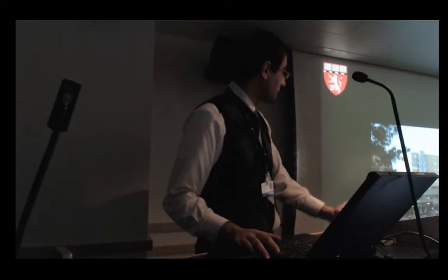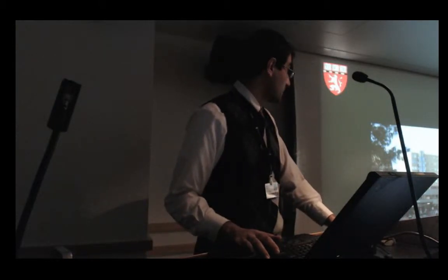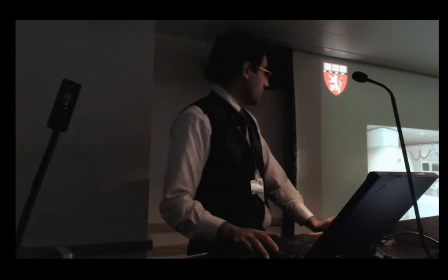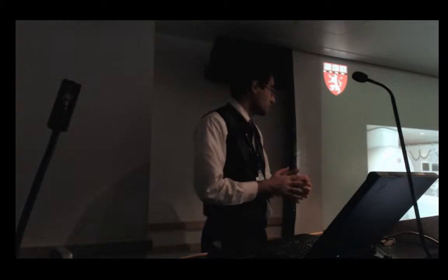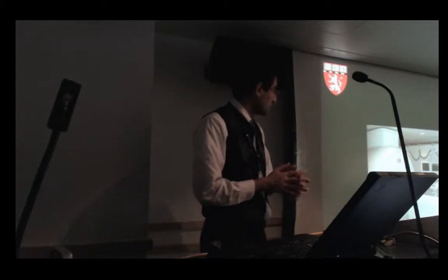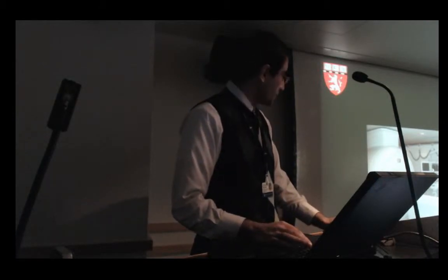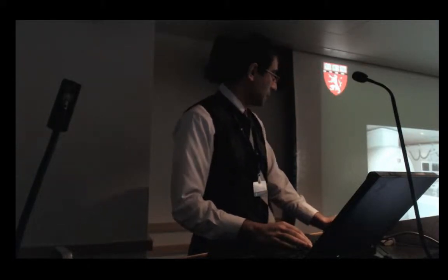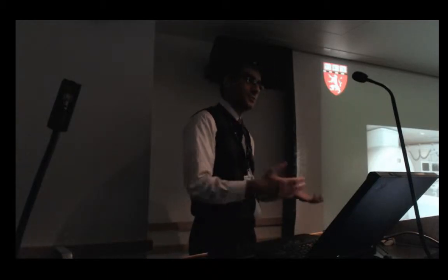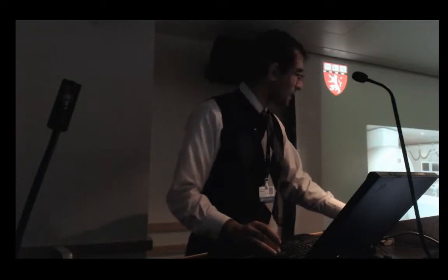We are located on the sixth floor of the main building at Boston Children's Hospital. We have a 1.5T magnet, and most of our patients are pediatrics: children, young children, infants, and neonates. You can see we have two monitors for the parents. They would like to be close to their children. And we have an MR compatible anesthesia because the children are scared to go inside, and we have to put them under anesthesia so we can avoid motion artifact in our images.